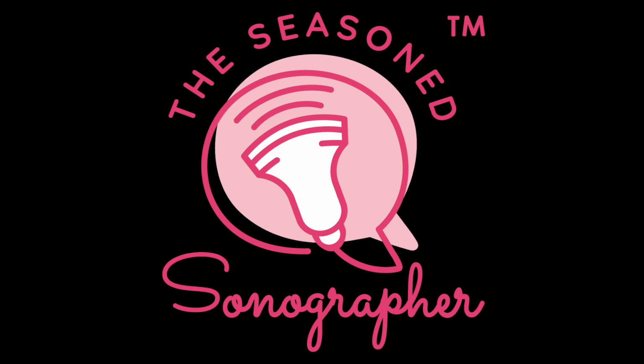When you find a fetal demise or a failing pregnancy, be sure to very delicately and gently communicate that with your patient. Be sensitive when you're discussing early pregnancy loss. There are times when there's just uncertain viability, and you can express that follow-up is necessary, that sometimes it just takes time to confirm whether it's just an early pregnancy and we can't see it, or whether it is an abnormal pregnancy.